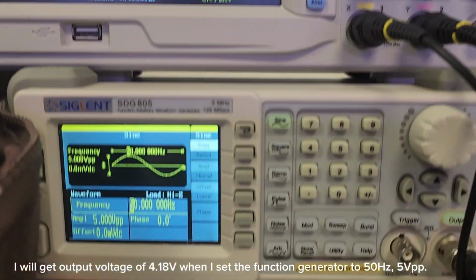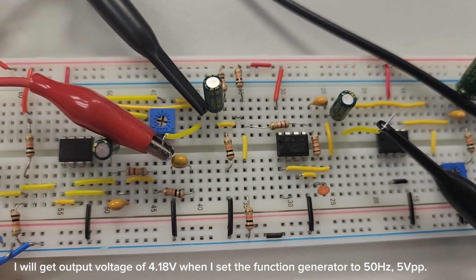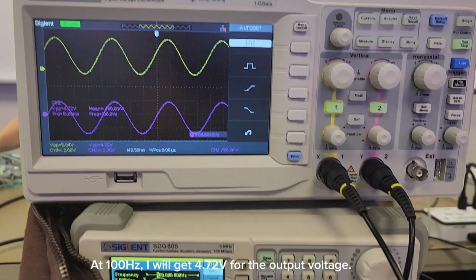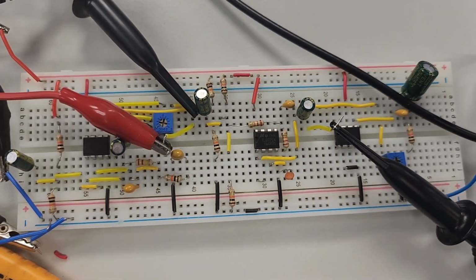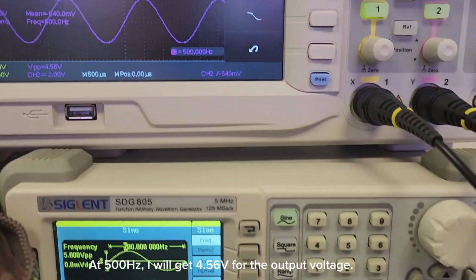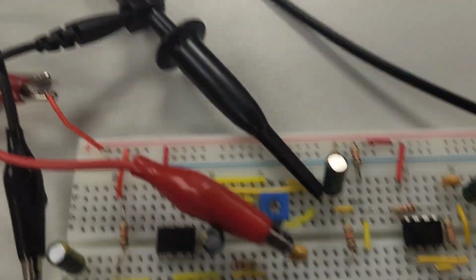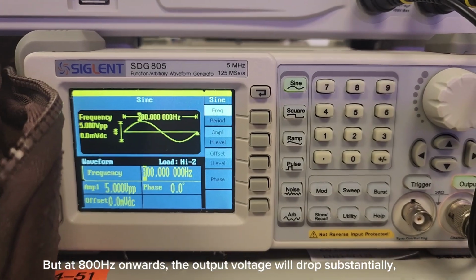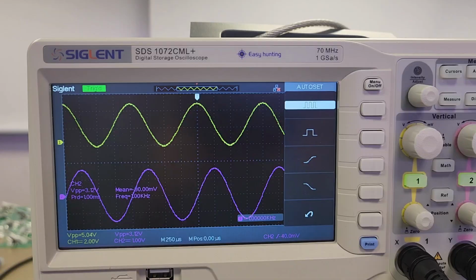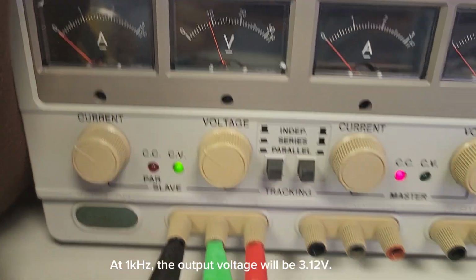I'll get an output voltage of 4.18 volts when I set the function generator to 50 Hz, 5 volts peak to peak. At 100 Hz, I'll get 4.72 volts for the output voltage. At 500 Hz, I'll get 4.56 volts. But at 800 Hz onwards, the voltage output will drop substantially, giving me 3.92 volts. At 1000 Hz, the output voltage will be 3.12 volts.